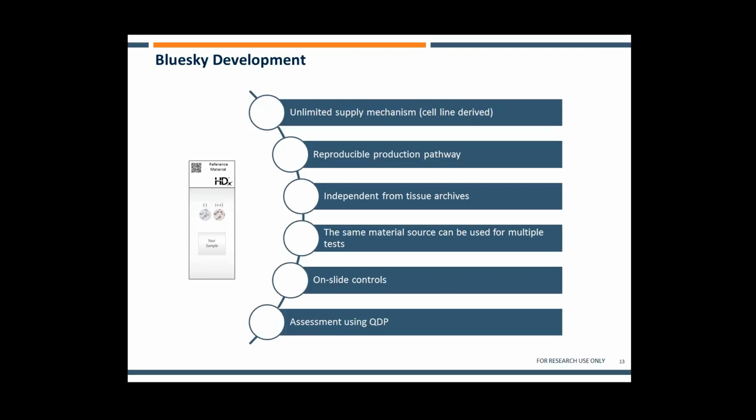And in our development, it was critical to us to find a reproducible method of QCing our material, and we undergo a series of assessments using quantitative digital pathology. And it's at this point I would like to hand you over to Martin, who will further explore the value of quantitative digital pathology.